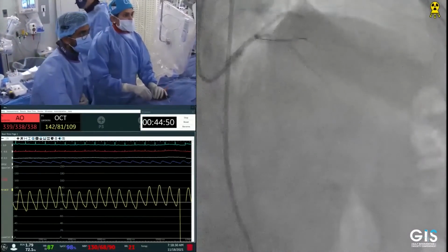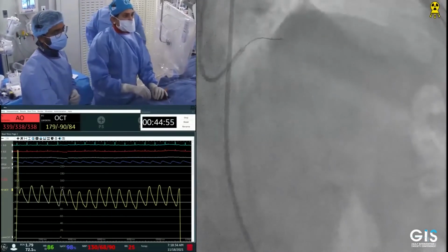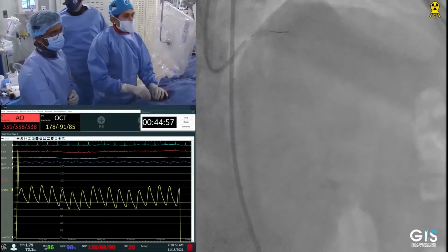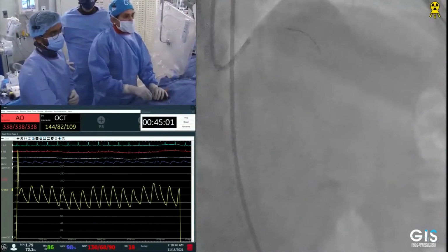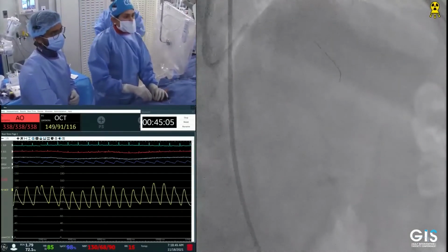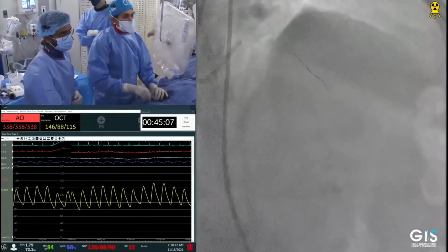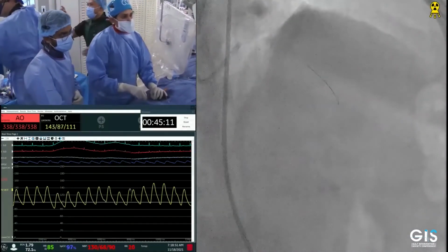George, this is Mohammed speaking to you. Thank you very much for this interesting case, which is a usual case. In most of the centers you don't have OCT, but here it's available, and sometimes if you need another view, you can have it. If you don't have imaging, tell him to fix the camera.